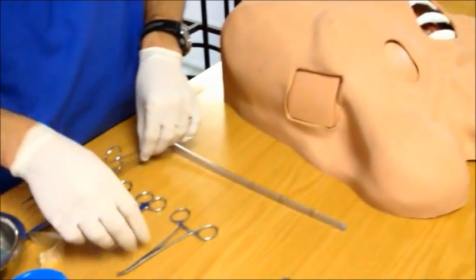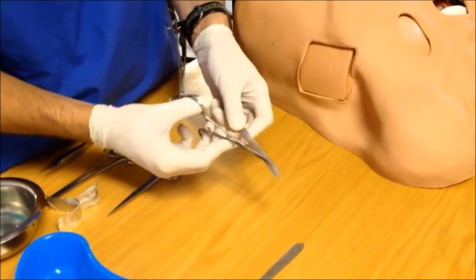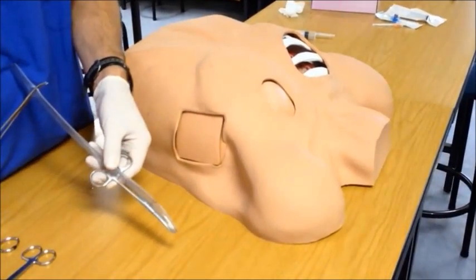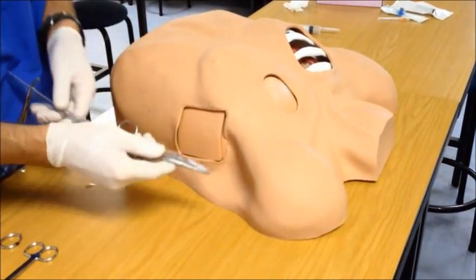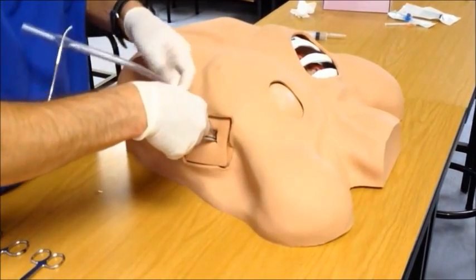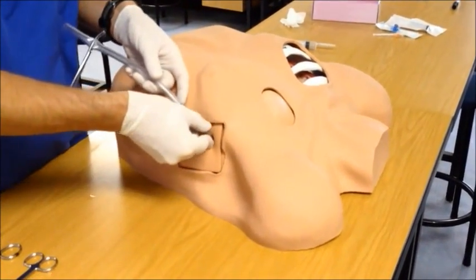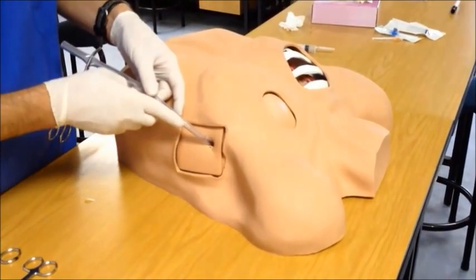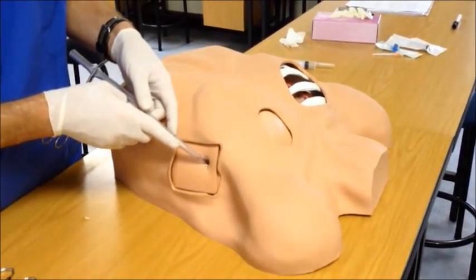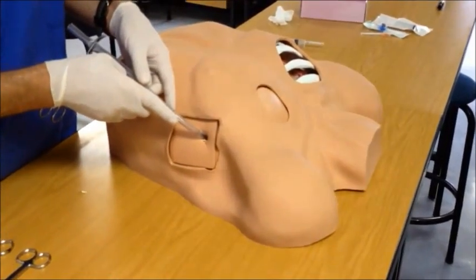Now it is time to prepare the tube for insertion. The back end of the tube remains closed off as shown, and at the venting hole closest to the tip, insert your curved artery forceps. You can now use this artery forceps to gently guide your tube into the chest cavity. Confirm that your tract is open and gently insert the chest tube. Once inside the chest cavity, remove the artery forceps and aim the tube in an apico-posterior direction. The chest drain should be placed deep enough so that all vent holes are safely inside — approximately 15 cm in a standard male, slightly shallower in a slight or skinny adult, and slightly deeper in an obese or muscular adult.